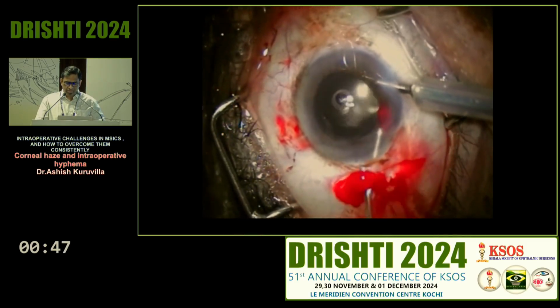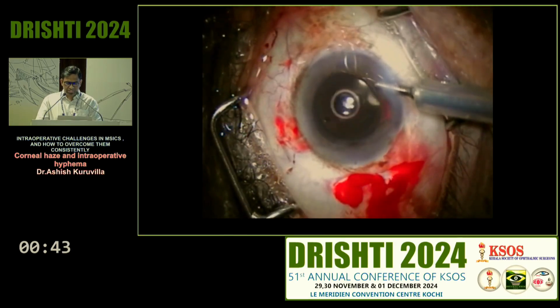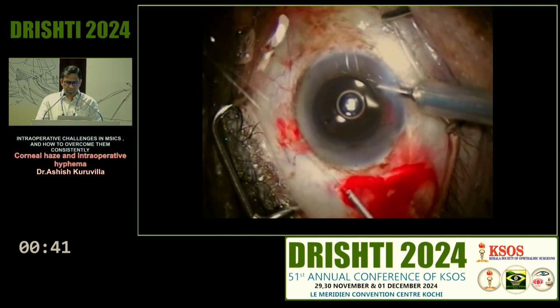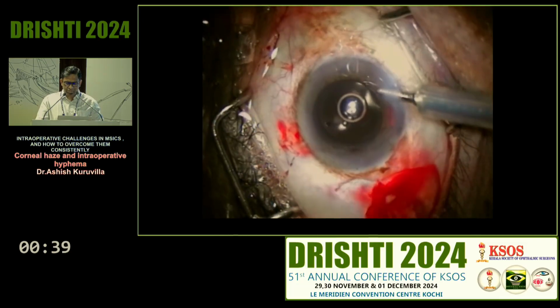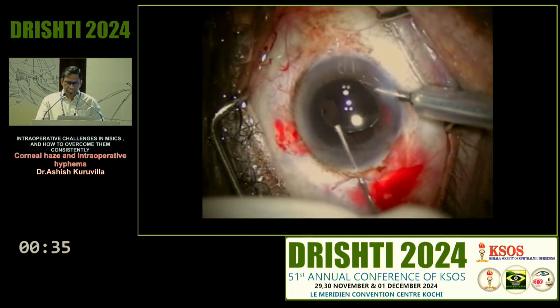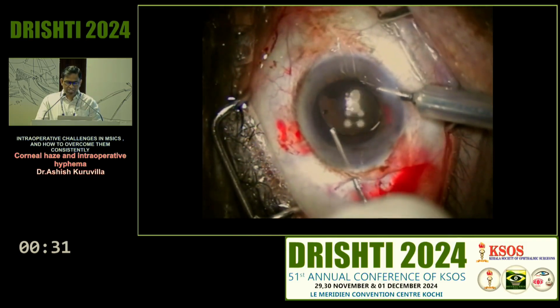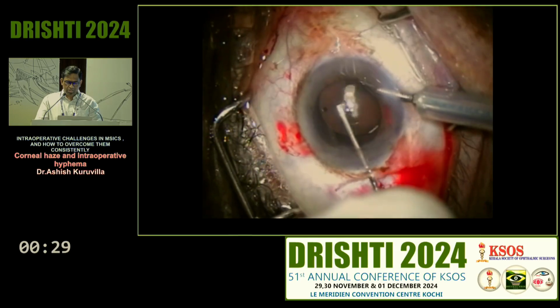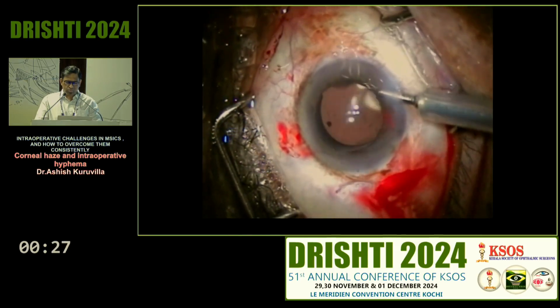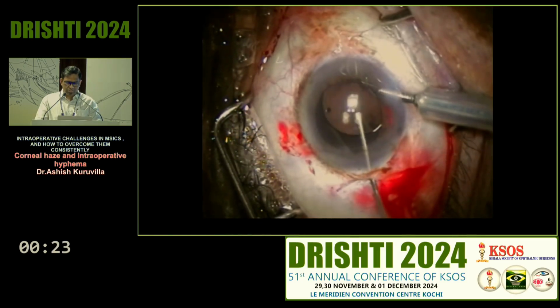So external lip, when you make very small incisions, this is one thing you will tend to have more of bleeding into the eye, and unless the eye is very well formed, you can have this challenge. The other thing is, when you have hyphema, sometimes it tracks behind the IOL and onto the posterior capsule. You must wash out all that. You can see there was absolutely no glow, but now you can see after washing out it becomes clear.